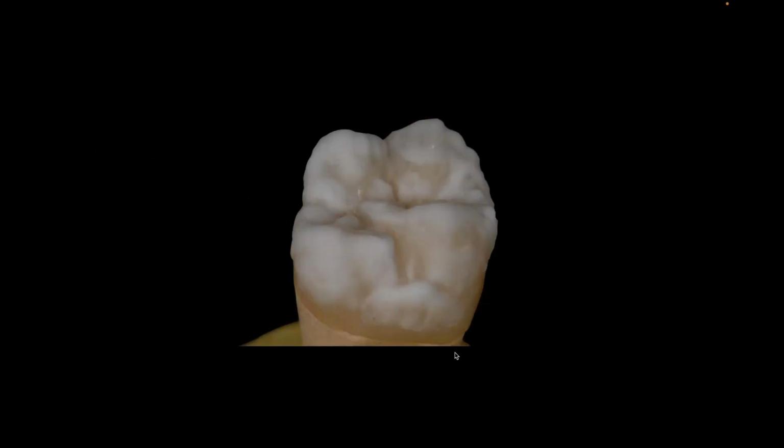Now, as the courses became more and more advanced, I stopped cutting them back and I would just build the dentin structures and then teach them to build the enamel structures. But interesting enough, when technicians come into my office looking for a job, I would sit them down and they would tell me, well, I've been a ceramist for 20 years. And I say, okay, here's what I'd love you to do. Build me the dentin on a single first molar. And they would look at me like I was crazy, because what they were used to was building a full crown and then grinding it into shape at the end.